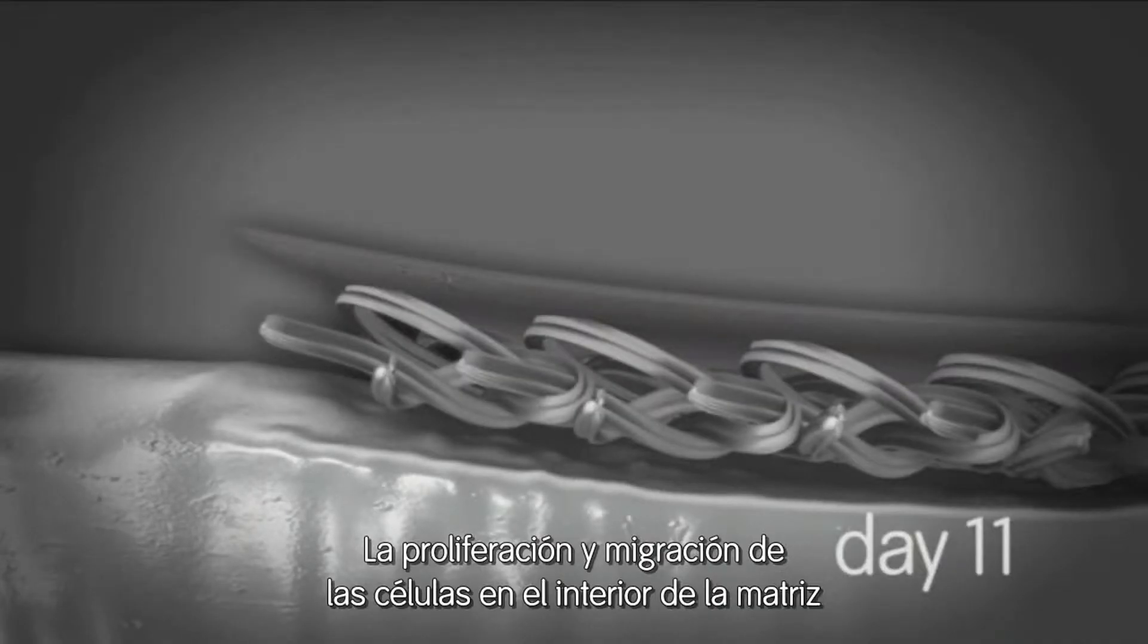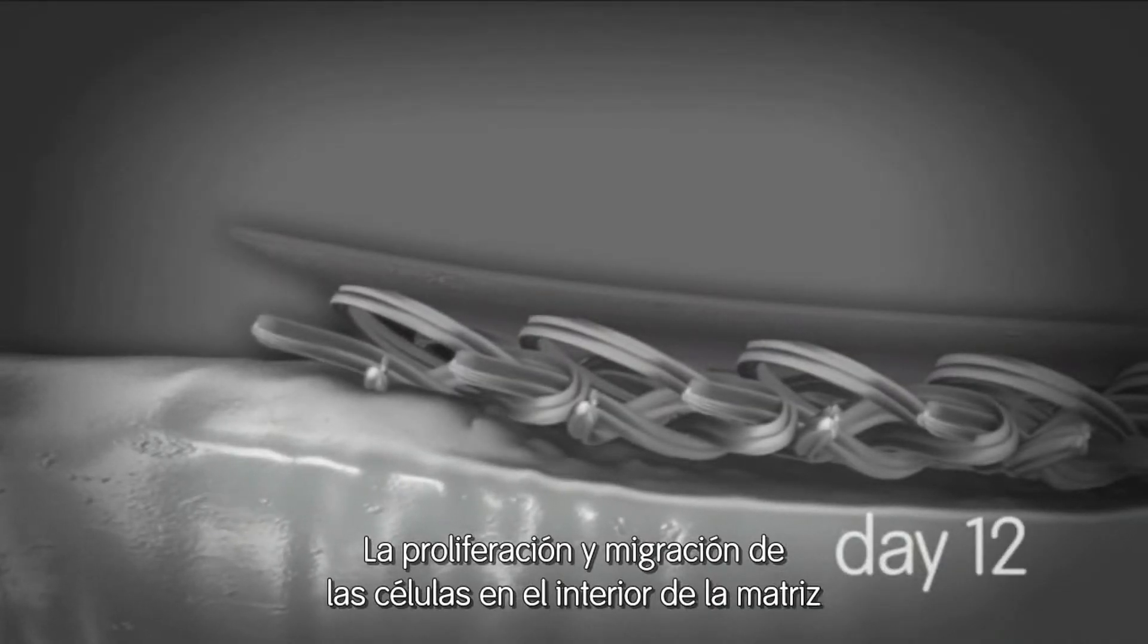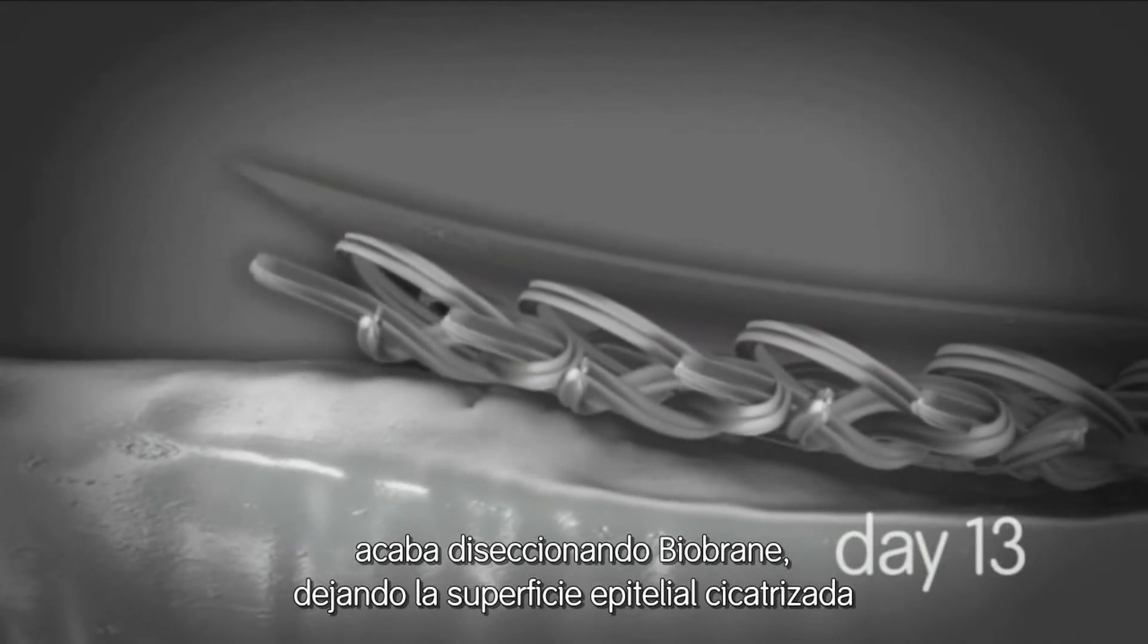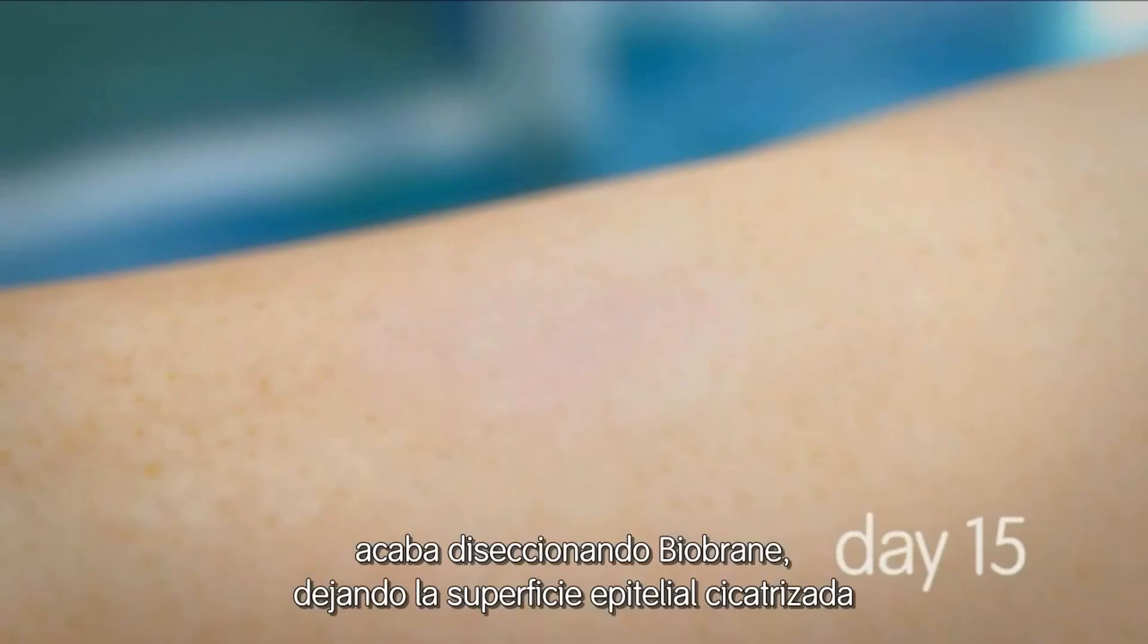Cell proliferation and migration along the inner aspect of the matrix eventually dissects the Biobrane, leaving a healed epithelial surface.